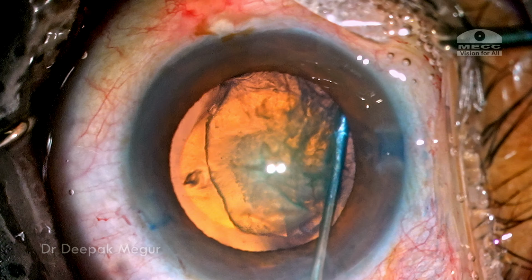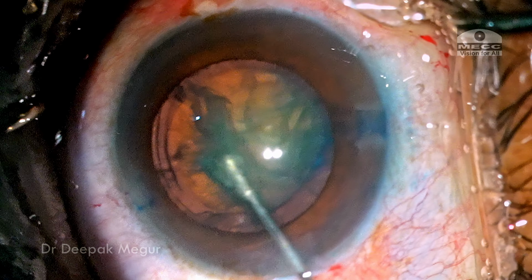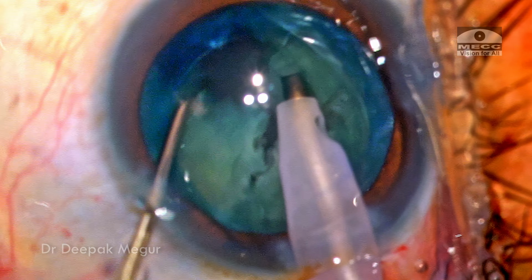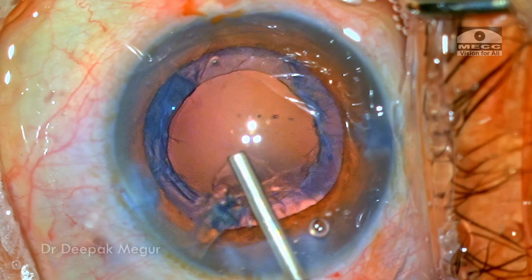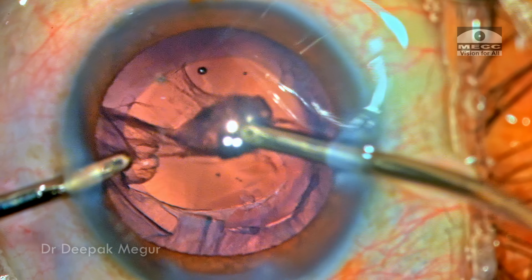When you're doing hydrodissection, the hydrodissection seems to be complete. The nuclear rotation is also quite free. So there's no evidence of any zonular weakness now. During phacoemulsification, everything goes on very smoothly, so not an issue at all. The first time I noticed the zonular weakness is during cortex aspiration, that too in this particular quadrant.